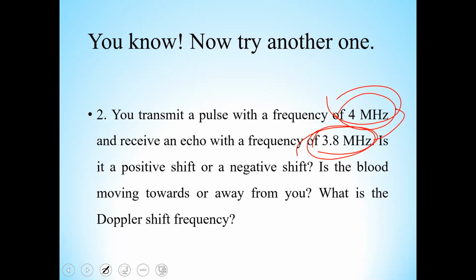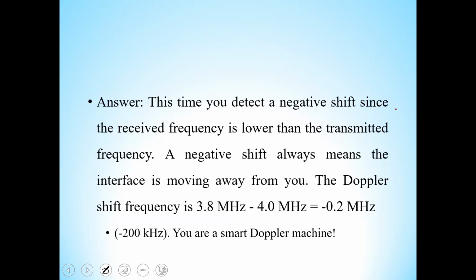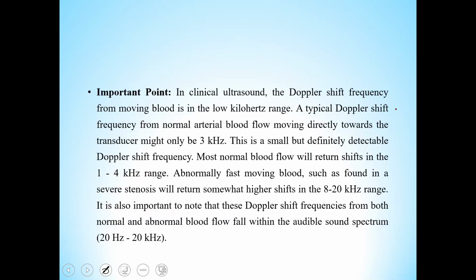So if any structure is moving away from the transducer, then the receiving frequency will be lesser than the transmitted frequency. And if any structure is moving towards the transducer, then the receiving frequency will be greater than the transmitted frequency. Is it clear now? Yes, sir.